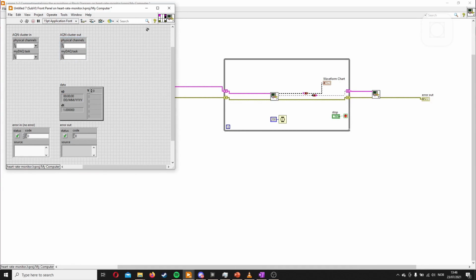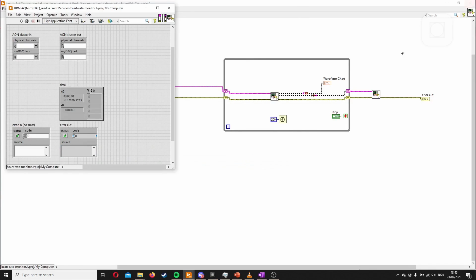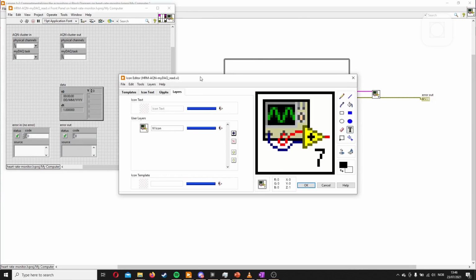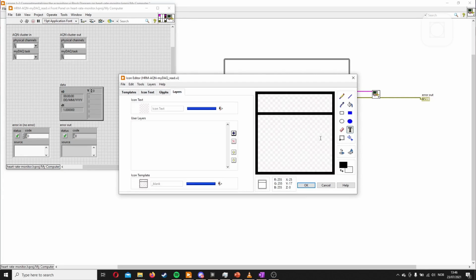And this one there. Save. And this one we will call almost the same. We'll just use the name there and we'll call it read. We'll change the icon as we did last time. Delete this one, press delete or the X, use the template here, and then white the backgrounds. You don't need to white the backgrounds, but I prefer doing that. So it's still part of the acquisition.